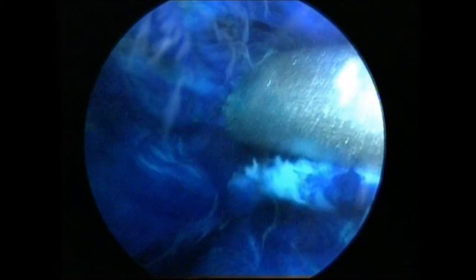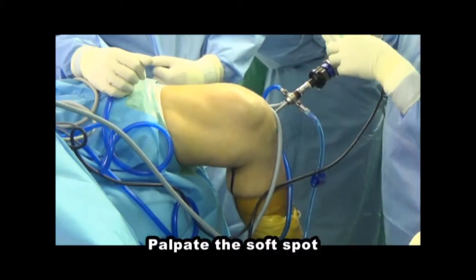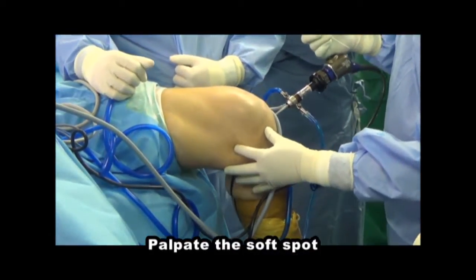Before doing this, we treat the underlying intraarticular pathology — usually a degenerative meniscal tear or cartilage lesion.